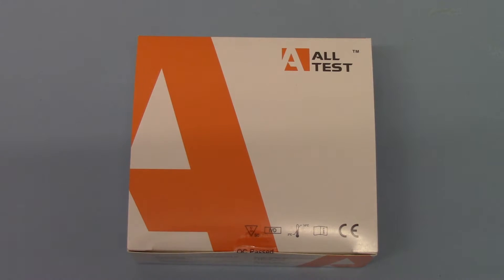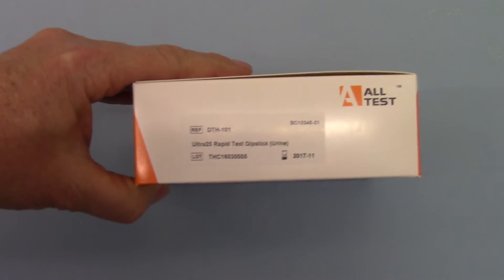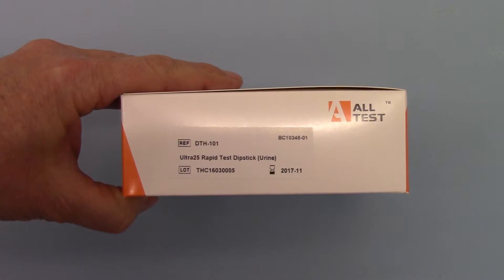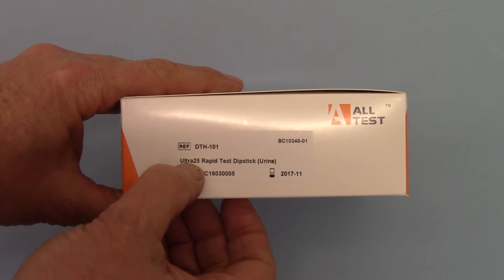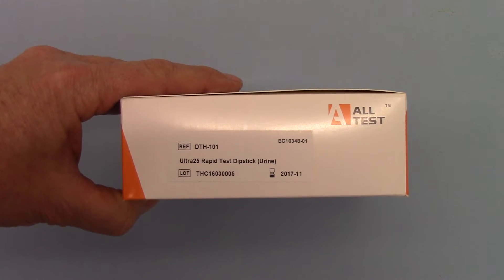This is the outer packaging showing the standard Alltest Strip package of 50. We rotate you through — you can see the catalogue reference remains DTH 101. We've had this labeled specifically with an Ultra 25 nanogram rapid test dipstick for urine.